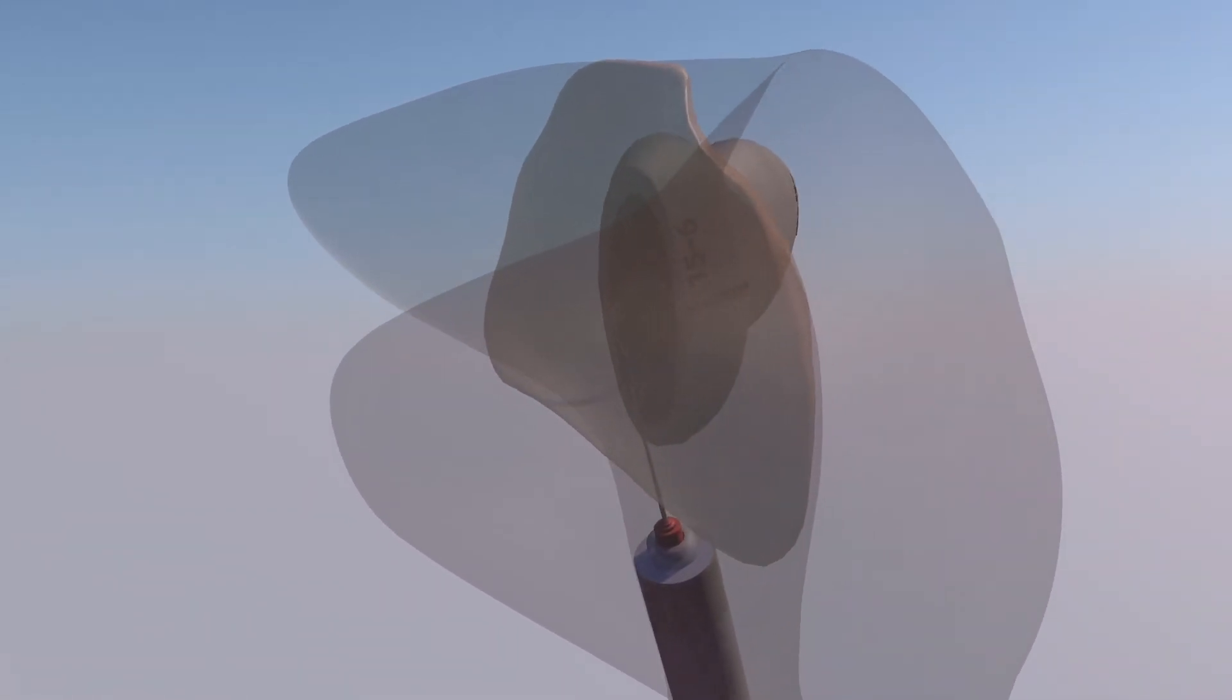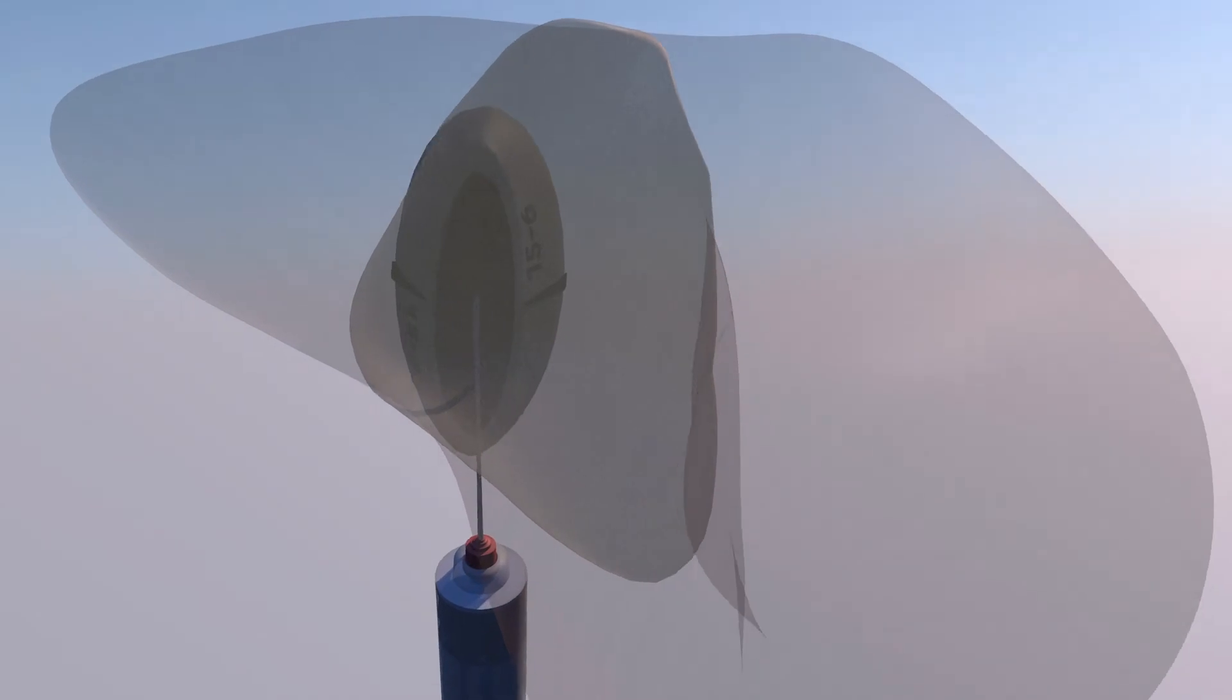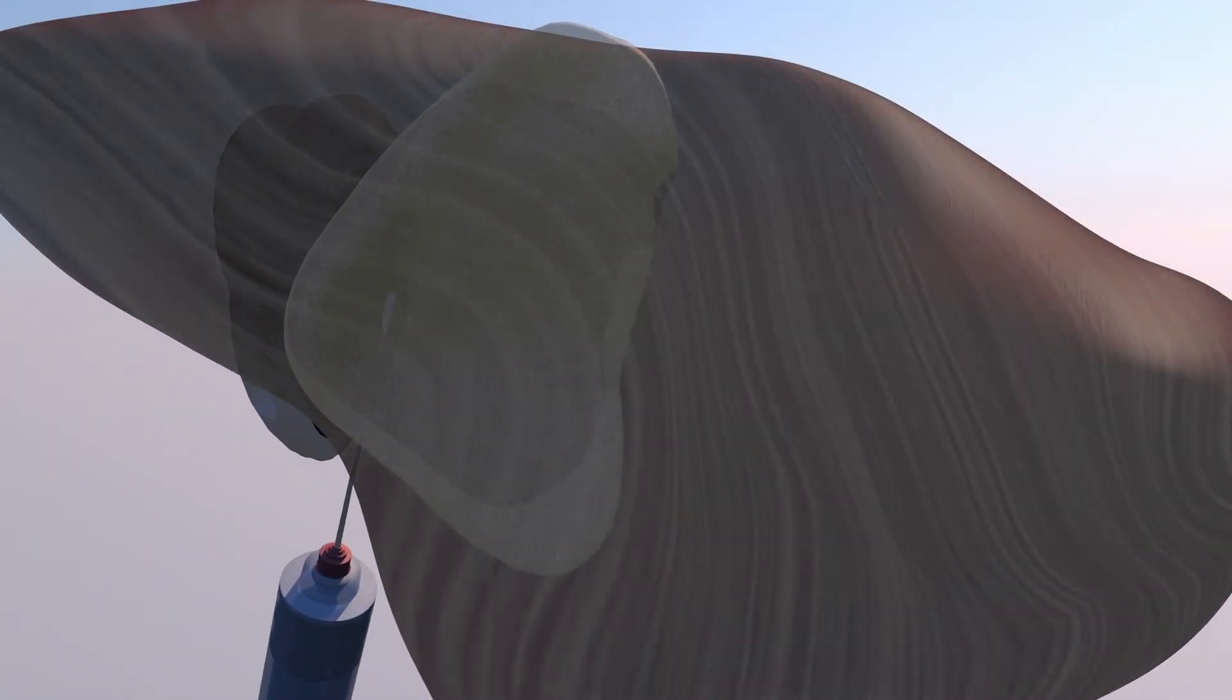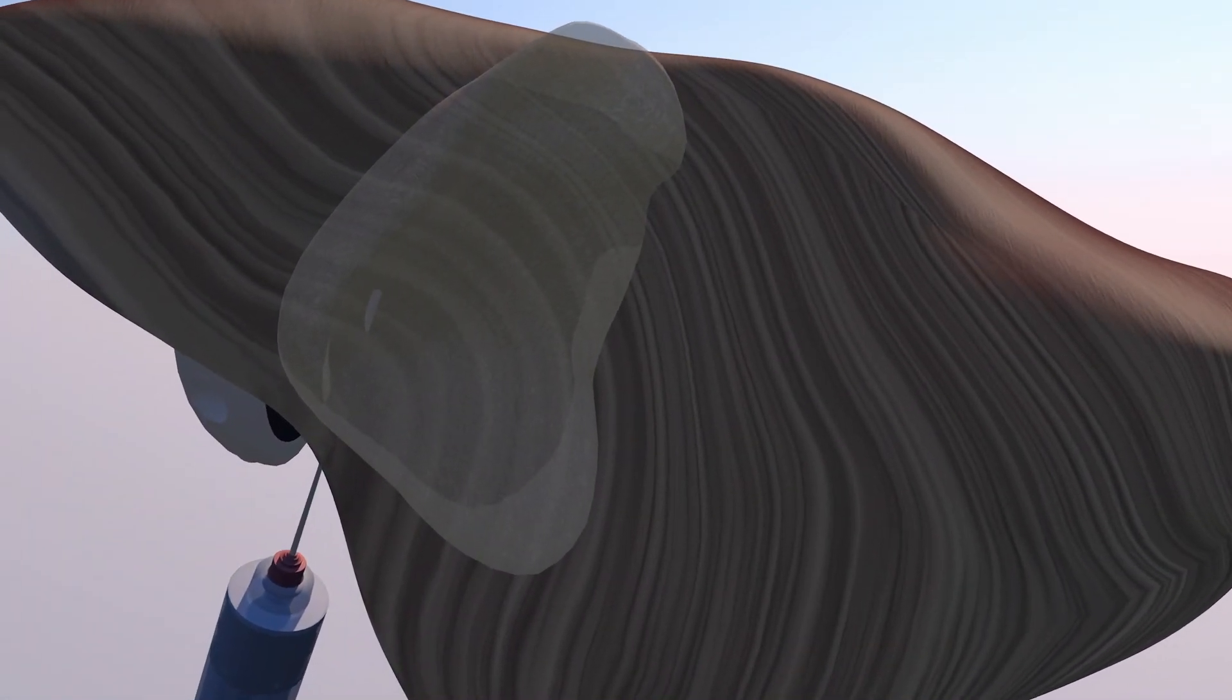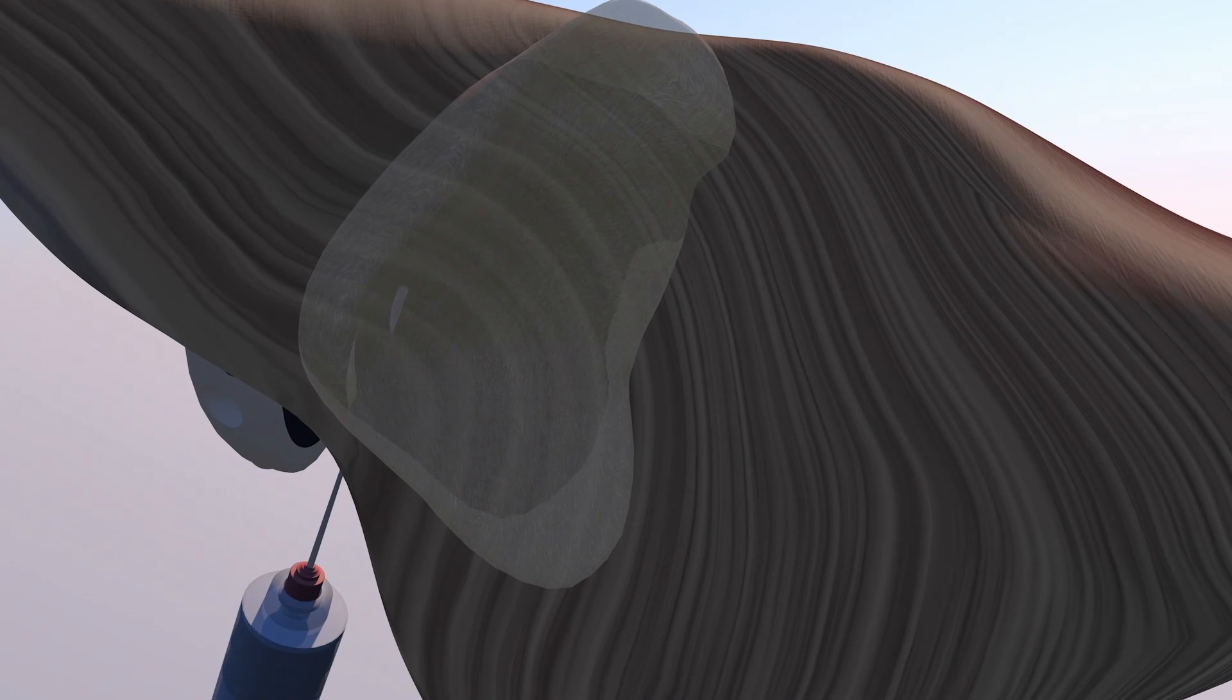And here again is this thickened bursa. And the subdeltoid bursa can spread quite a bit around over the rotator cuff and the proximal humerus. And again, here it is in relation to the deltoid muscle.